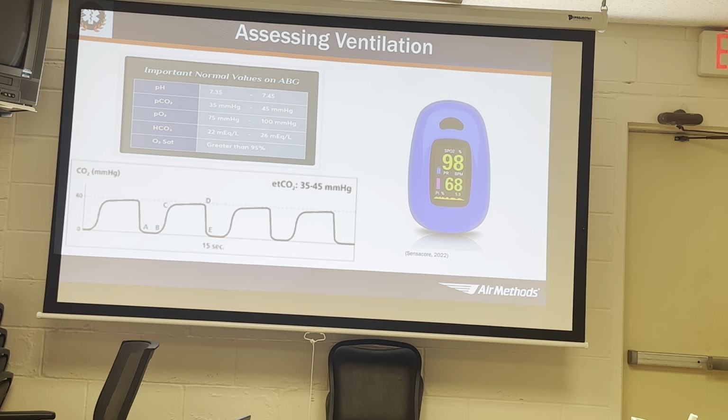And then of course your ABG. Everybody knows how to read an ABG, I hope. If not, we teach a class on it. I'm just joking. Making sure that they've got the appropriate CO2, that we're oxygenating them well, and then of course whether they're compensating their pH.